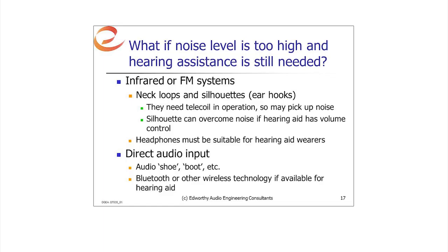And contact the owner of the interference generating equipment, which might be the power company. Again, make use of the disability legislation, advocacy organizations like the HLAA. But what can you do if the noise level is still too high and you still need hearing assistance?